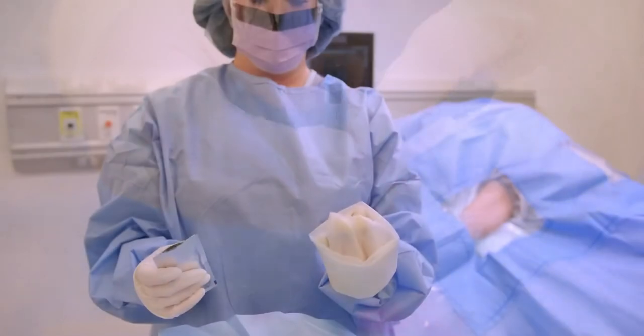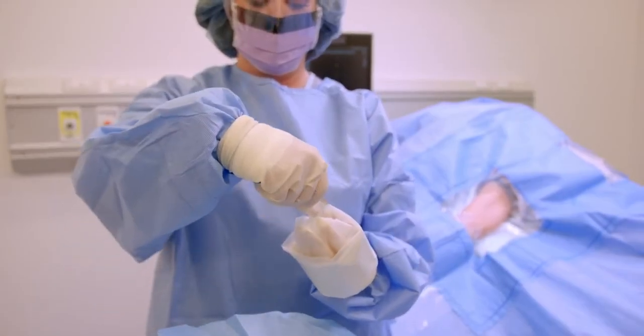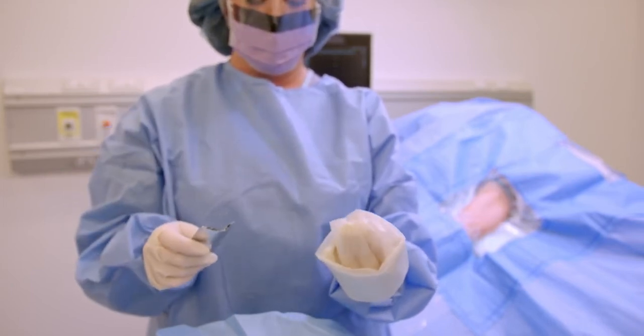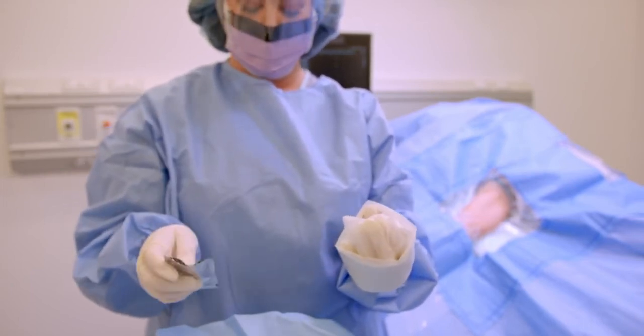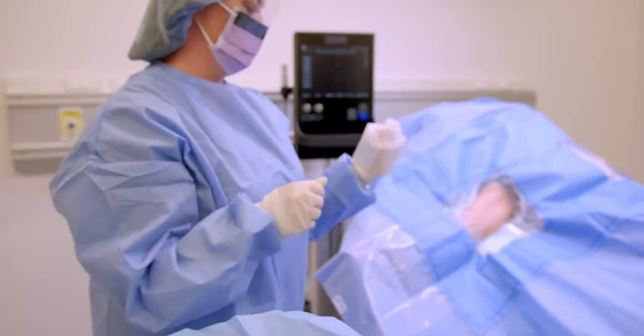During the insertion procedure, the ultrasound transducer is covered with a sterile ultrasound transducer cover. To apply the cover, place ultrasound gel on the probe head prior to beginning sterile setup, or place sterile gel inside the closed head of the cover as the cover is prepared.